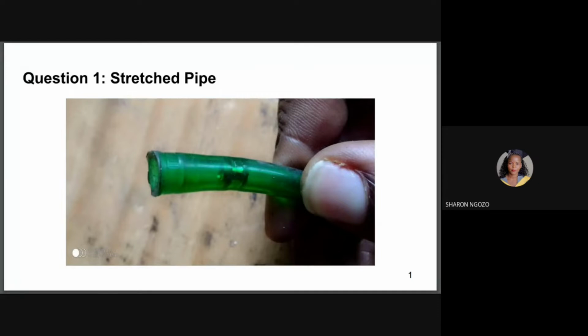As you can see on the diagram, when working on a concentrator and you're connecting pipes, make sure you cut off the ends of the pipes that have become stretched or are loose over time with a cutter, and then reconnect it. Use a tie wrap to give the pipe a tight fit. In this way, the pipe won't come loose again. Thank you.